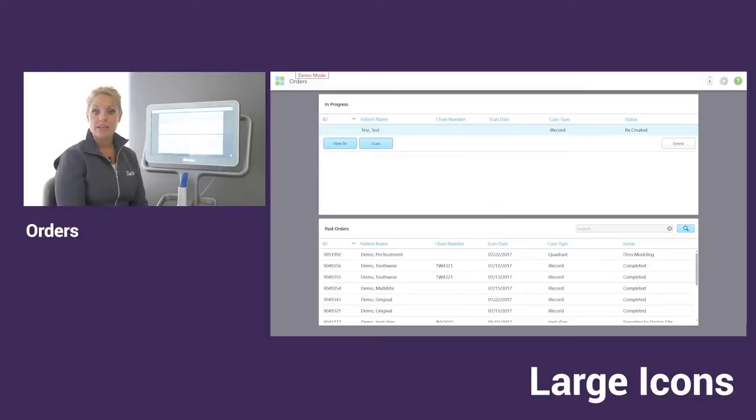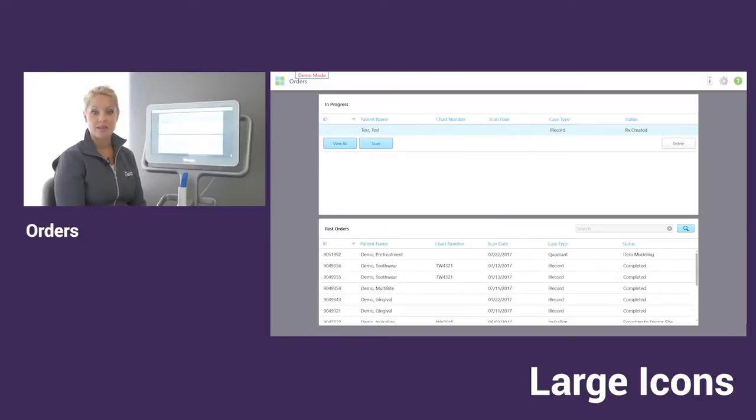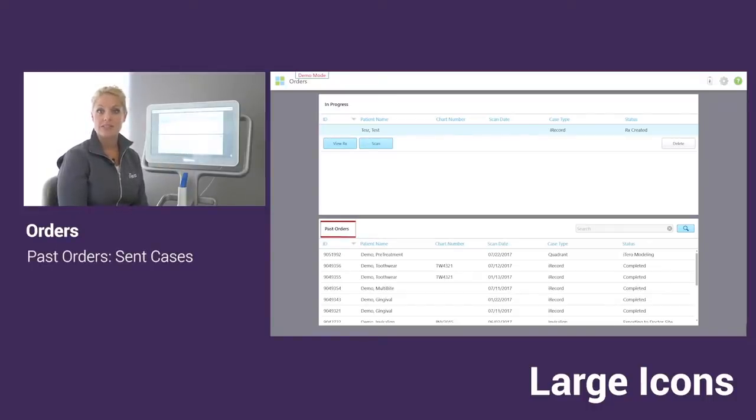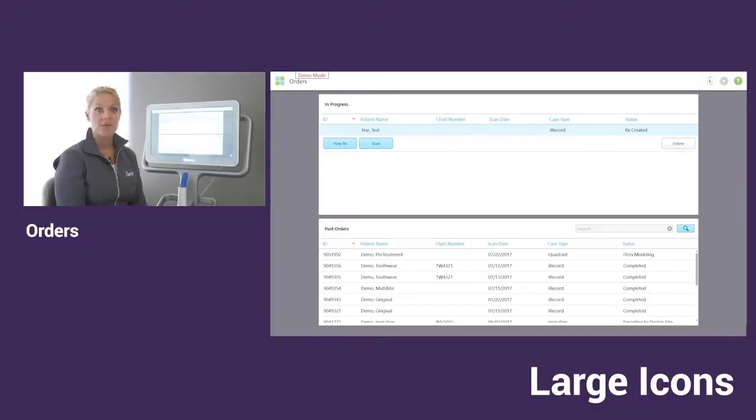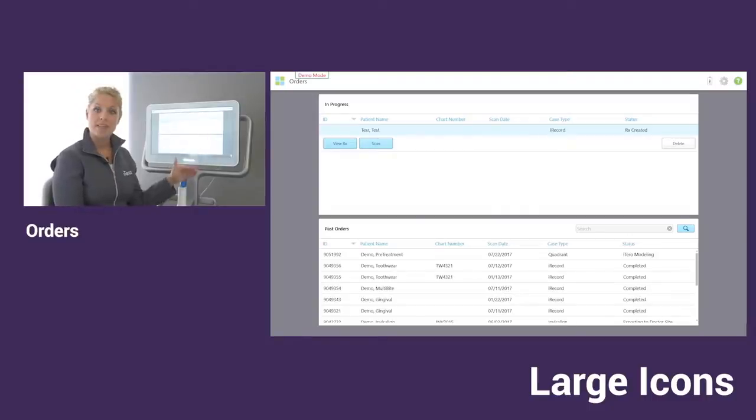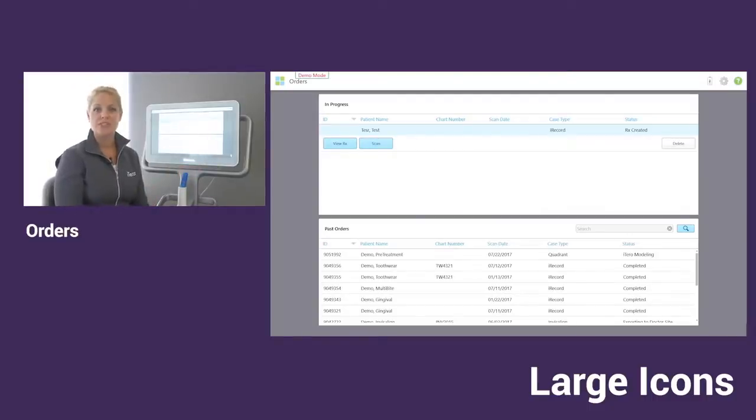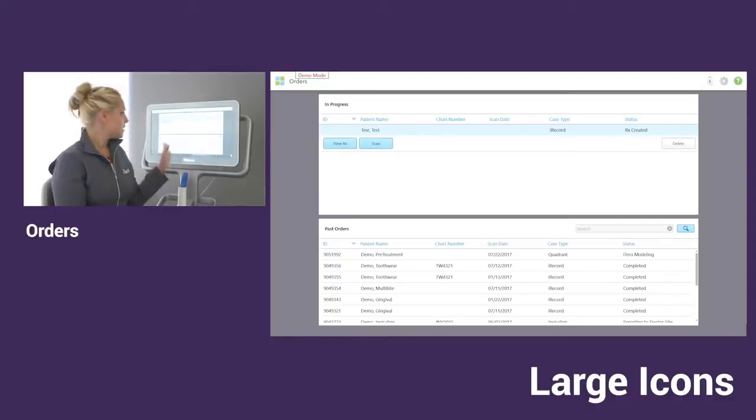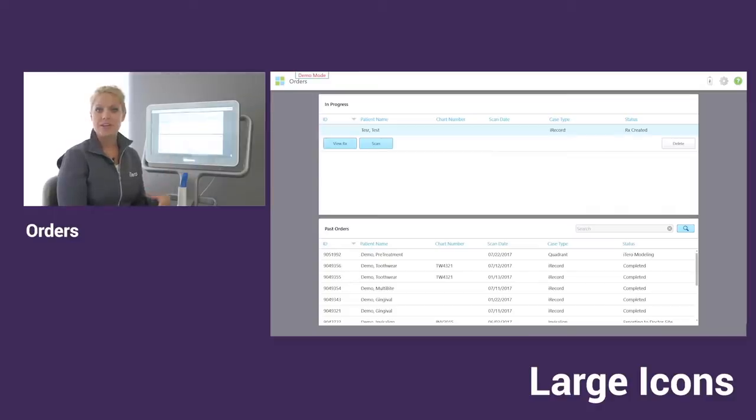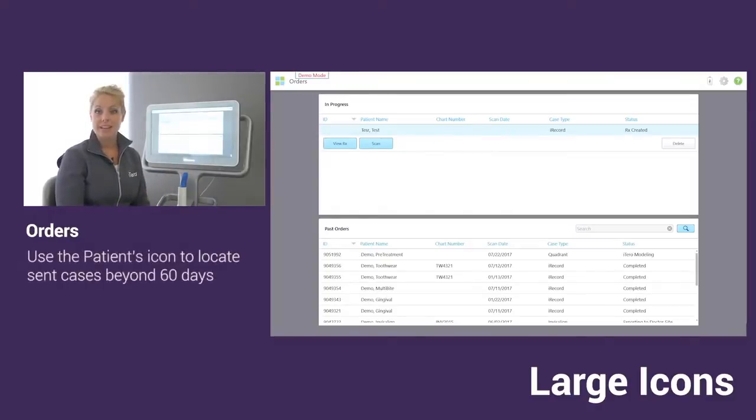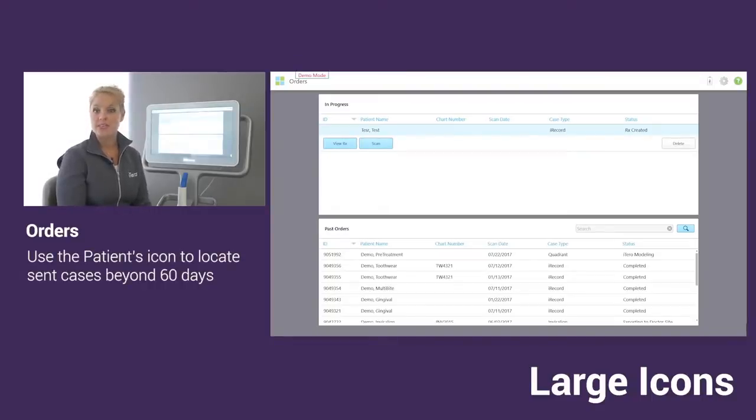Now once your case has been sent, it's going to drop down to the lower half right here in your past orders and it's going to stay listed there for about 60 days. After that time, you will notice the names will start to drop off the list just so you don't have to scroll through hundreds of patients to find your most recently sent scans. Typically after that time period, your case has already been delivered. If you do need to reaccess any of those scans that have been previous to that date, you can always find all of those scans in your patient's icon.